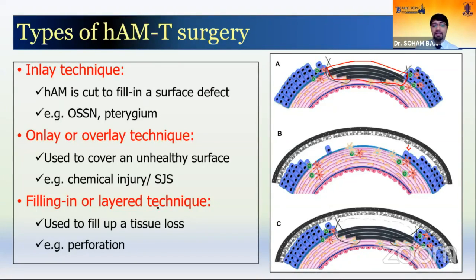And then we have the filling-in or layered technique. This is a hybrid between the two, where layers of amniotic membrane are piled on top of each other. This is used to fill up tissue loss or, say, a small perforation.